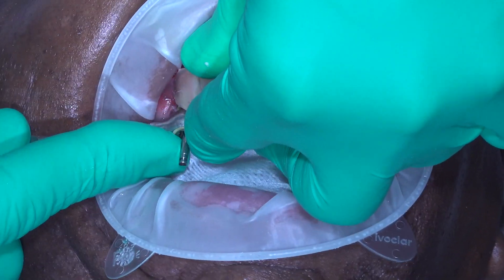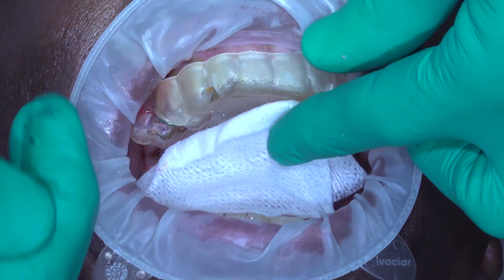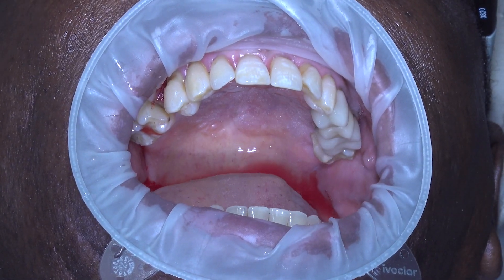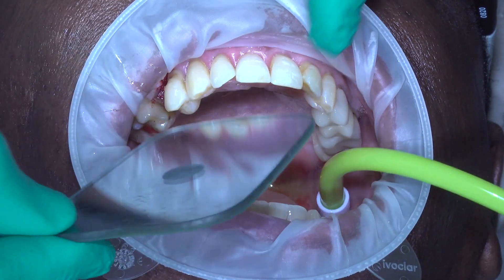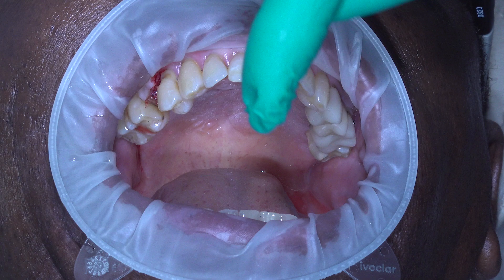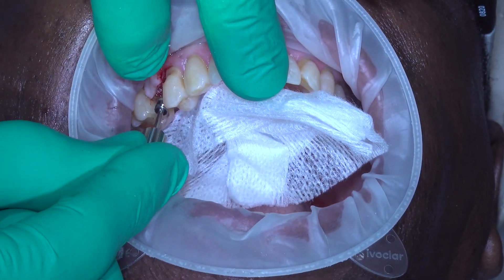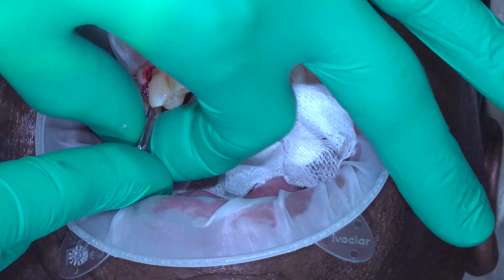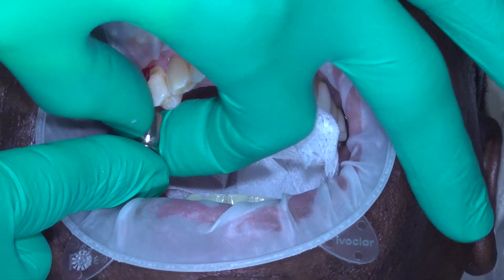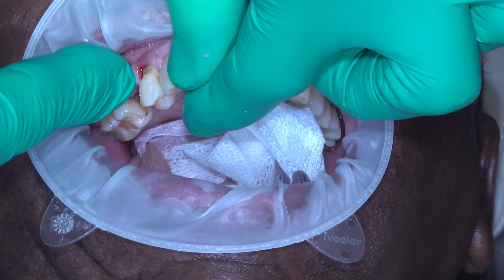I could have just gotten on it with the wrench and gone all the way down to depth, but that would have created a very high insertion torque and doesn't create any area for bleeding. I want to make sure my torque is a little bit lower for bleeding purposes. We have a perfectly placed implant at just about 3 minutes and 48 seconds into the procedure. The implant is placed perfectly symmetrical right in the central developmental groove. We place our 3-millimeter standard regular healing abutment, 3 millimeters tall, regular profile.